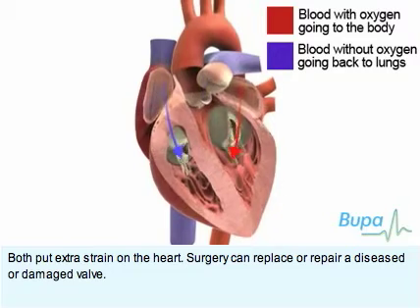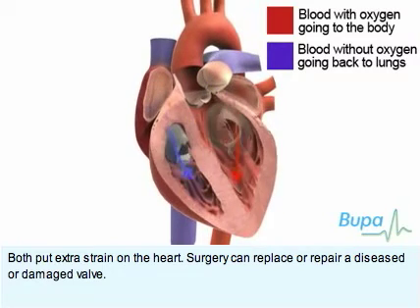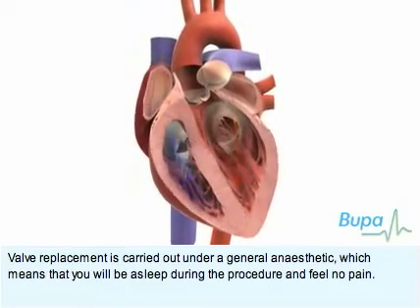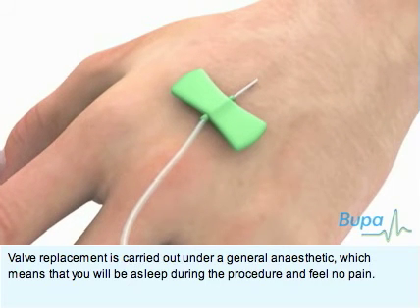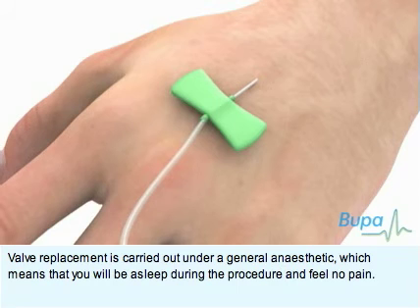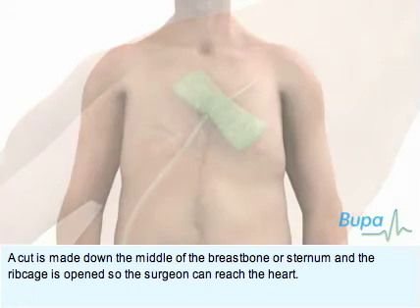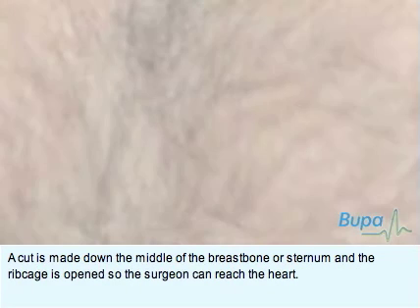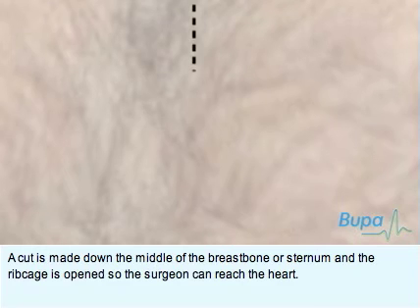Surgery can replace or repair a diseased or damaged valve. Valve replacement is carried out under a general anaesthetic, which means that you'll be asleep during the procedure and feel no pain. A cut is made down the middle of the breastbone or sternum, and the ribcage is opened so the surgeon can reach the heart.